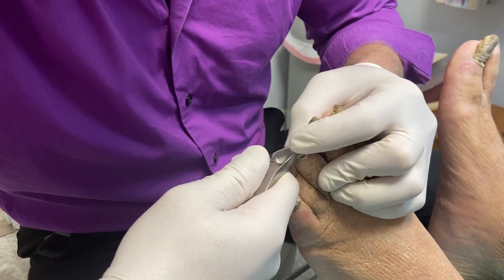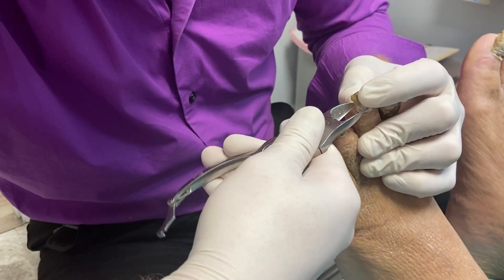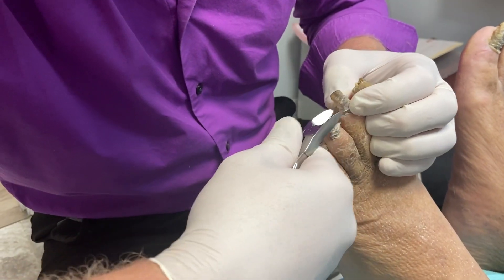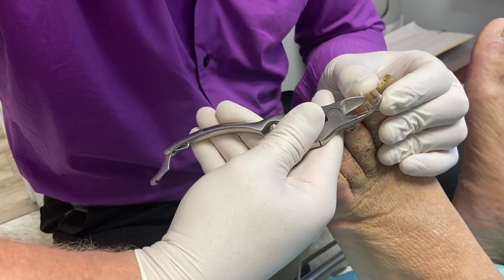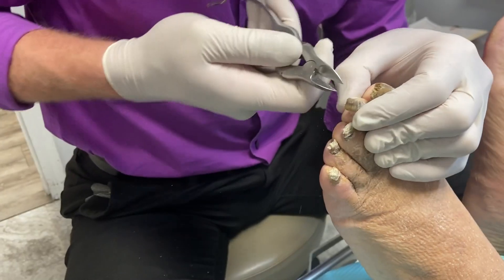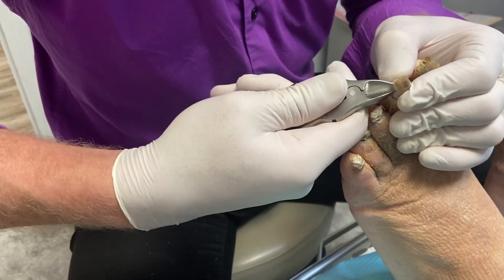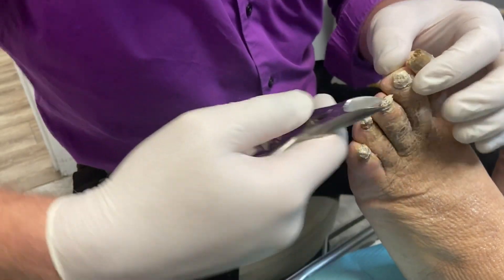One other thing you might see me doing is jumping across different toes, especially if I'm using the burr for too long on one toe, because you don't want to create any thermal injury to the patient — meaning I don't want to burn the patient by putting the burr on him for too long. You can see that dust is being sucked up by a vacuum tip attached to the burr; it gets a majority of the dust. I'm really glad I'm wearing a mask here, obviously.